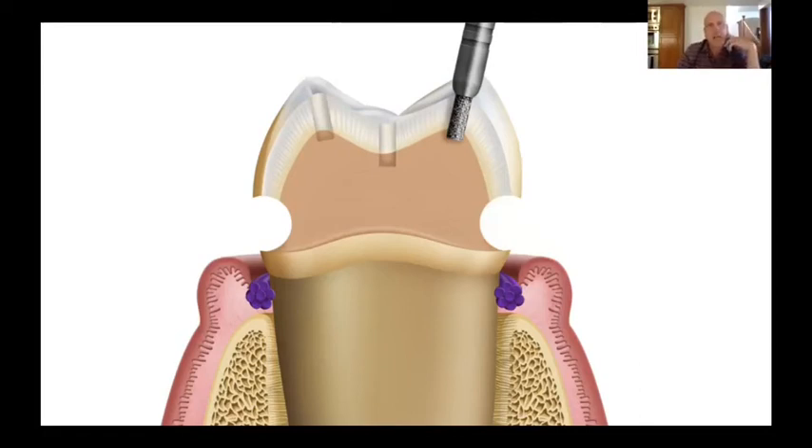Once we've done our margin reduction with the round burr, now we can go to placing our depth cuts. I usually place two depth cuts in the central groove, one in the mesial pit, one in the distal pit. Then I'm going to place depth cuts in the buccal cusp tips and the lingual cusp tips. If you want to skip one, skip the buccal cusp tip — you can have the patient bite together, put the mirror in, and pull their cheek away and see the buccal cusp tip. But the thing that drives us nuts in the lab is how dentists think they can have the patient bite together, pull the cheek back, and visualize what's going on with the lingual cusps. Nine out of 10 times the under-reduction is on the lingual cusp of a molar — because it's basically 100% humidity and dark back there. It's crazy to think you could see how much you reduced on the lingual cusp tip.